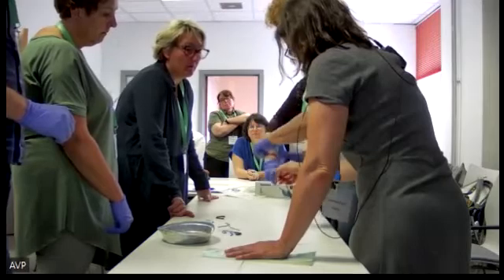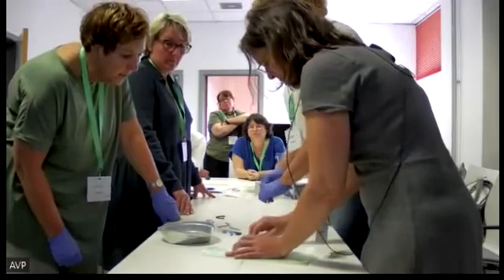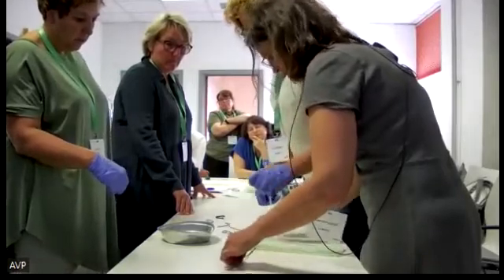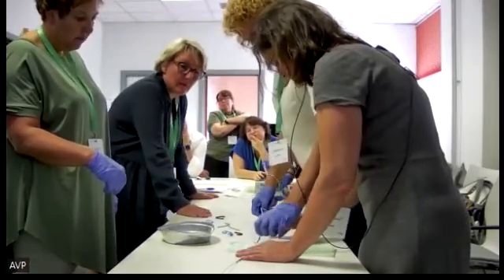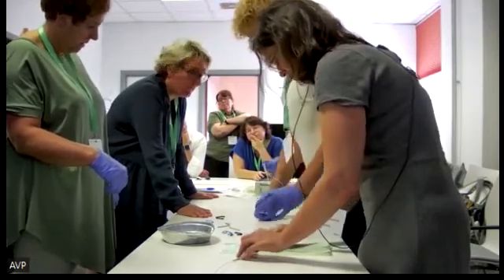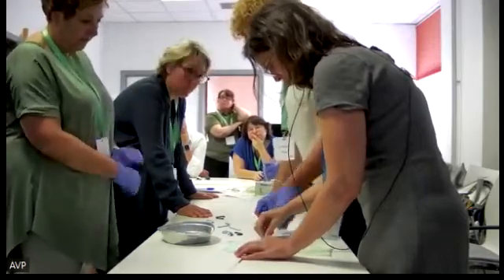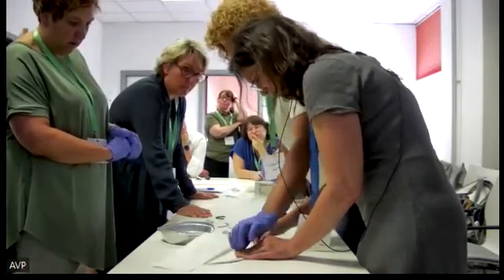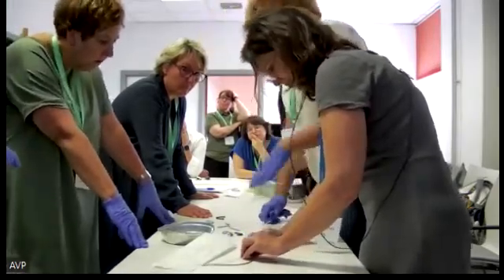It's easier. So it goes inside the bile duct like this, and the physician has the pusher in his hands, pushing separately. This is the papilla here, and this is the stricture there. So when we are here, the physician is still pushing the stent in with the pusher, up to the stricture. And then to release.